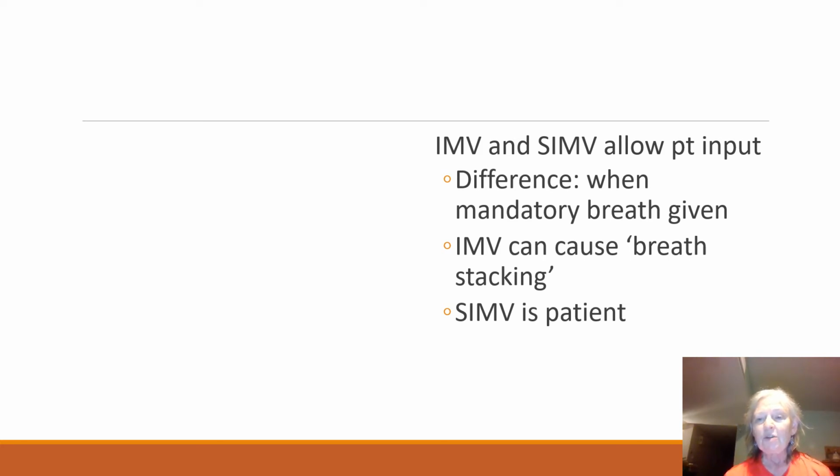However, some of the research is showing maybe not. We do try to use pressure support with it. That seems to help quite a bit too. But be on the lookout. These are some modes that may be disappearing from our machines.